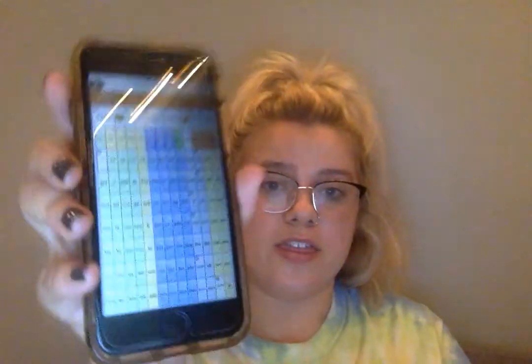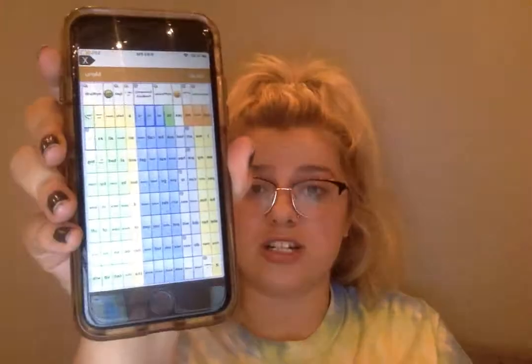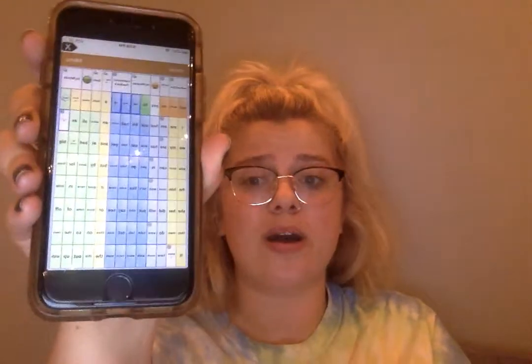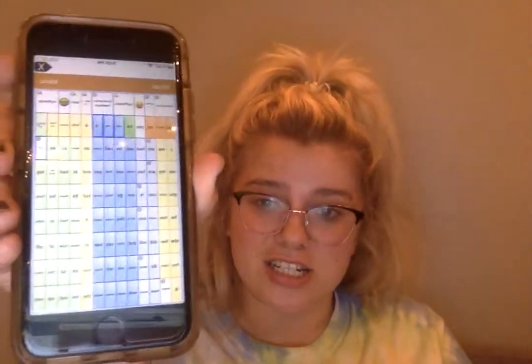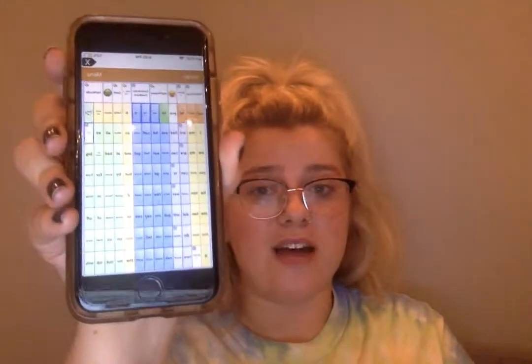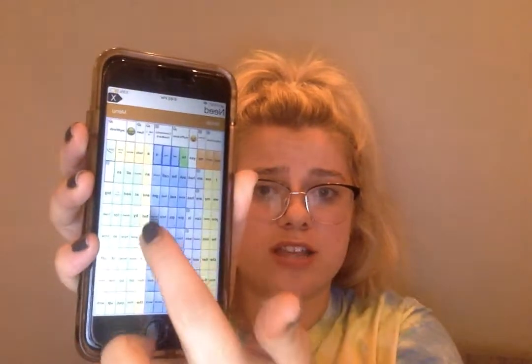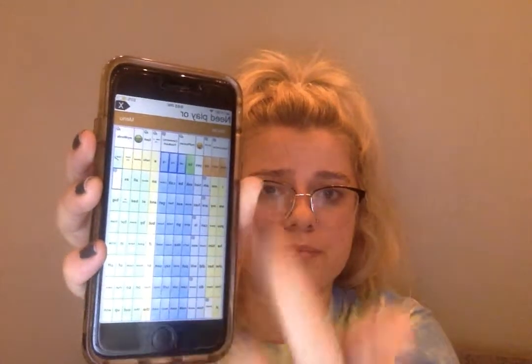Another one I want to show is called My Core. This is very much expanded. It has full words that you can use, but it does require fine motor skills and attention to detail. But again, it allows for more communication and allows the ability to ask more questions. But it works the same way. If you want to say something, you just click the button and it comes up to the top.